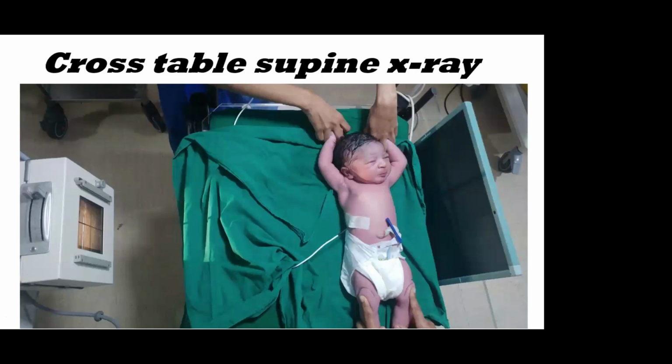So this is how we take a cross-table supine X-ray. Again, the baby is lying supine, flat on the table. Hands are drawn up so that the scapula and the hands don't cover the chest exposure. If I want to see the pathology on the left side, my plate should stay on the left side. If I want to see pathology on the right side, I'll put the plate on the right side, and the beam will come from the opposite side.